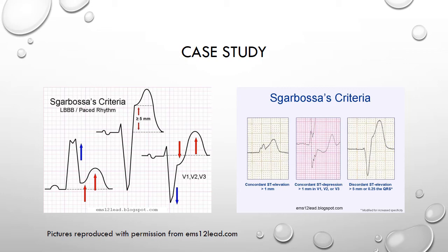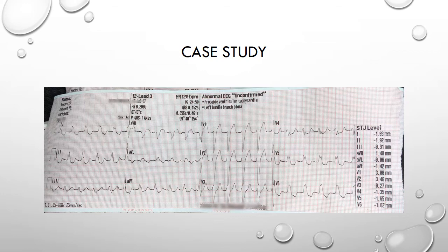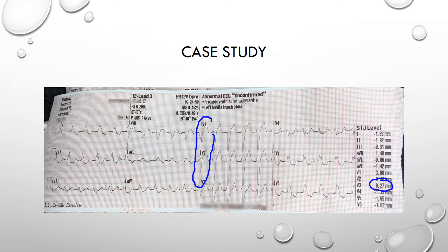If we apply Sgarbosa criteria to our earlier ECG, firstly we don't see any concordant ST elevation in any leads. Secondly, we don't have at least one millimetre of concordant ST depression in leads V1 to V3, although V3 is showing some depression of 0.27 millimetres — rather than the elevation we would expect to see with a negative QRS as in V1 and V2. Thirdly, in the leads with a negative QRS (V1 to V3) we don't have discordant ST elevation of five millimetres or more. This ECG does not meet Smith's modified criteria either.